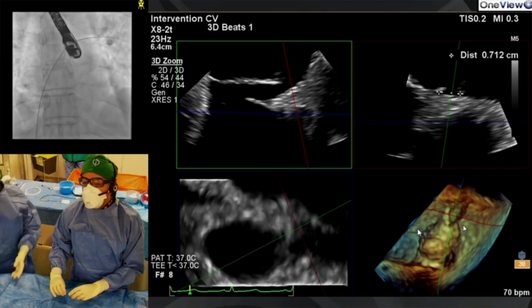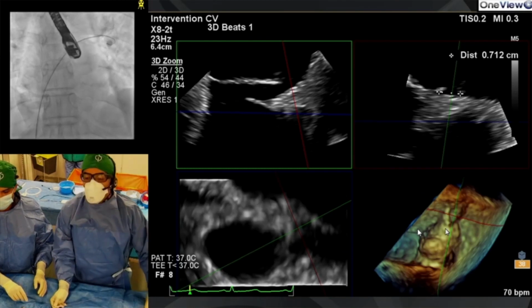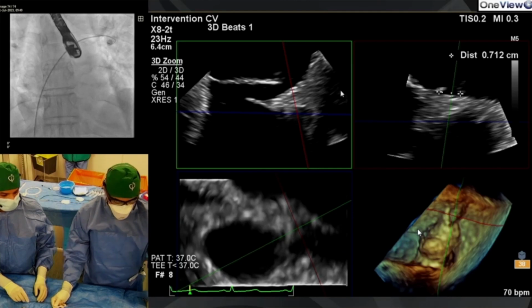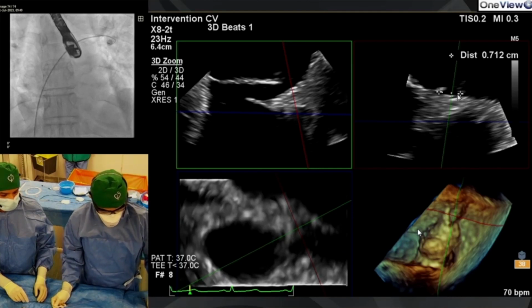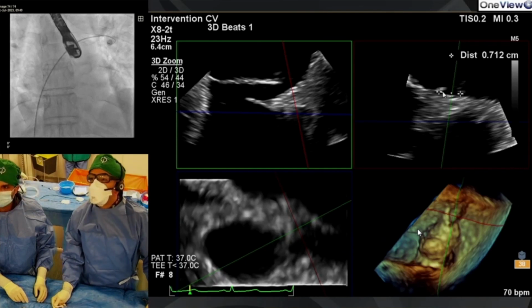Assuming we're not missing anything here, because I'm not sure entirely, which is why I'm looking forward to the wire coming in, and I'll explain why I think there should be balloon interrogation here. What's interesting is just at the top of the PFO. So once you're finished, I have got a wire across now. Yeah. So if you go live, then you can show that.